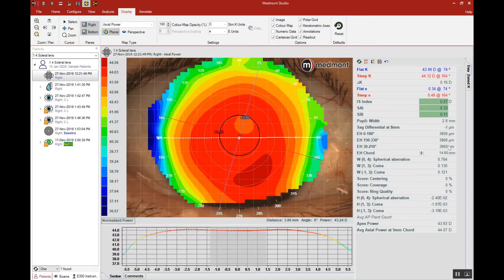When we look at the values we see 38.59, 38.68, and 38.69 sagittal depth — very near to 3900 microns. If we add in the fluid layer that we desire between lens and cornea, let's say 300 microns, then 3900 microns plus 300 gives us 4200 microns.